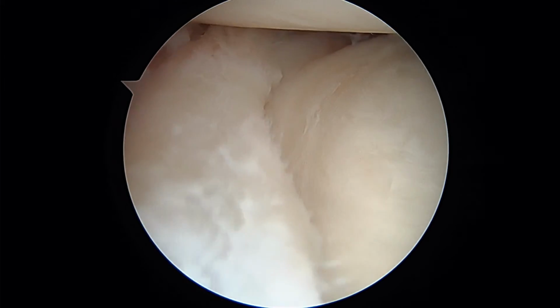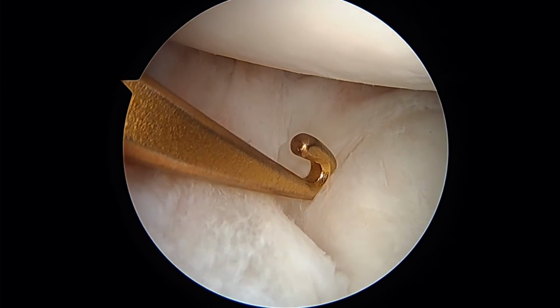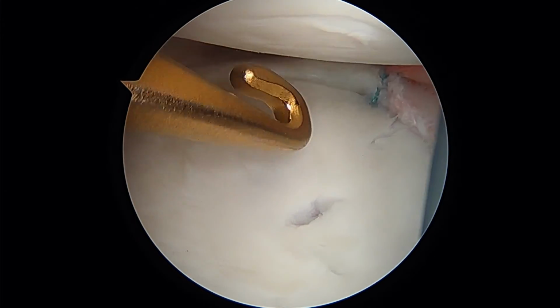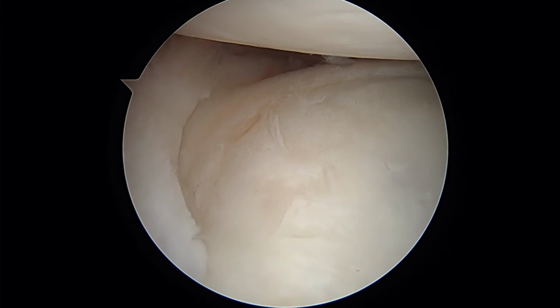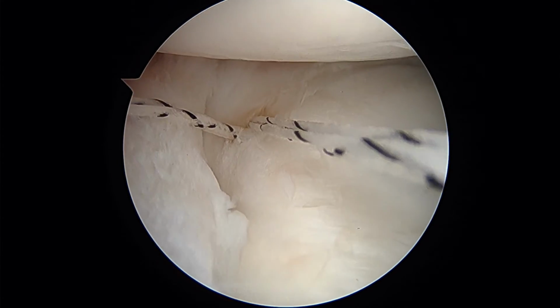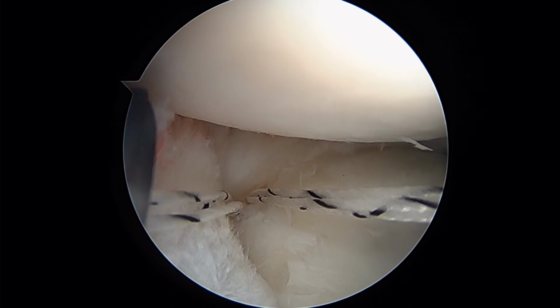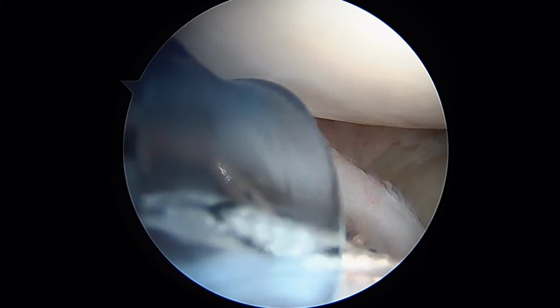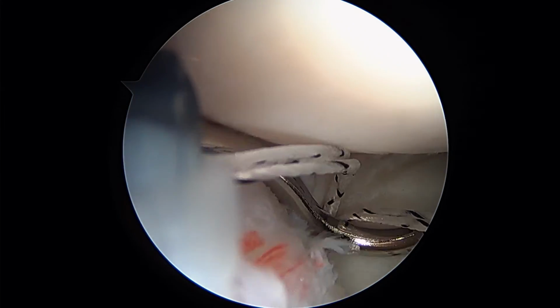My thought is that we're going to have to place a suture anchor in right here. See where the labrum is starting to peel away? This is where the instability was. So we're going to place one anchor in, kind of in a mirrored position to that one. We're going to place it right about here. Okay, so here's the anchor in the front. And here's our suture hook. We'll show you once we have this stitch done.